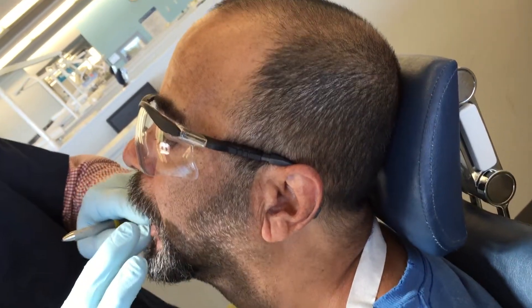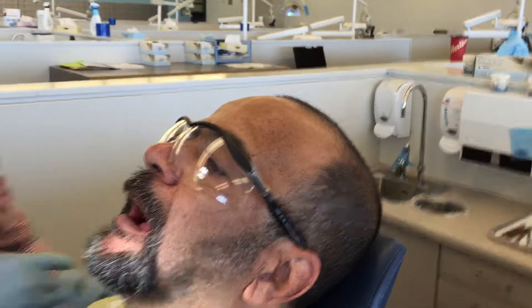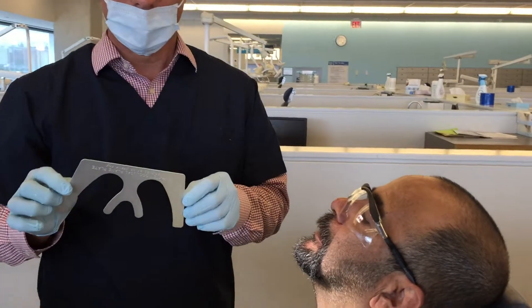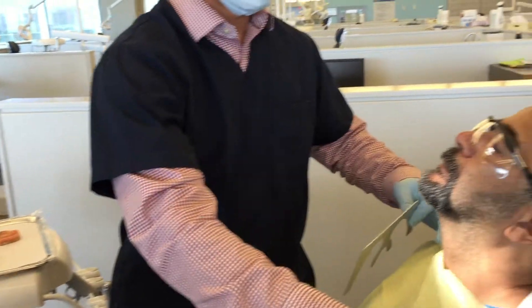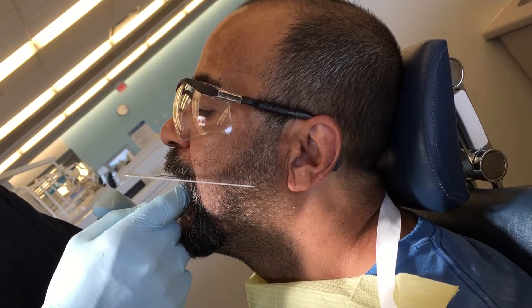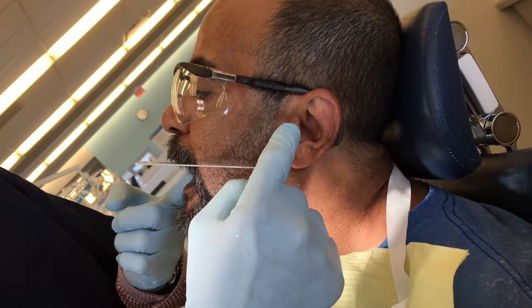Get you to open a little bit. I'm going to part the lips and now I'm going to check for things being parallel. It's very difficult to visualize if things are parallel, so we're going to utilize this device — this is called a Foxplane, designed by Dr. Frank Fox. We want to insert it in here, hold it firmly right up against the bite block, and make sure that this part of the Foxplane is parallel to the imaginary line at the inferior border of the ala to the tragus, to the middle of the tragus.